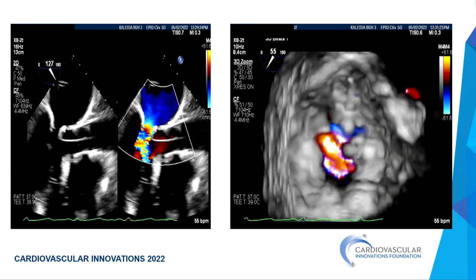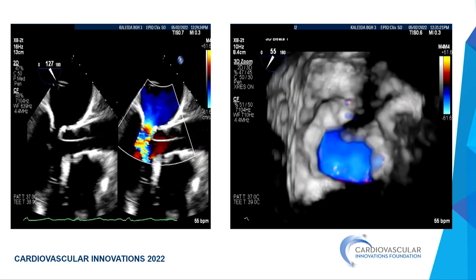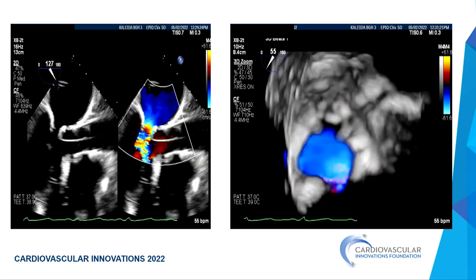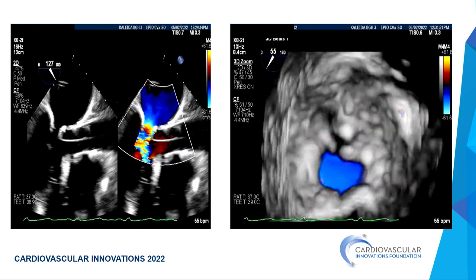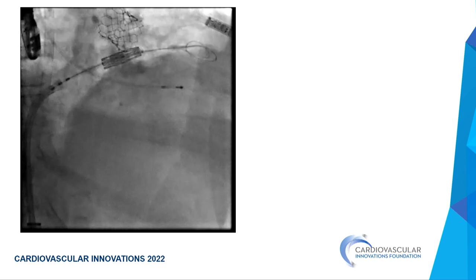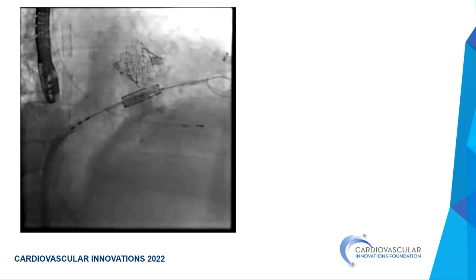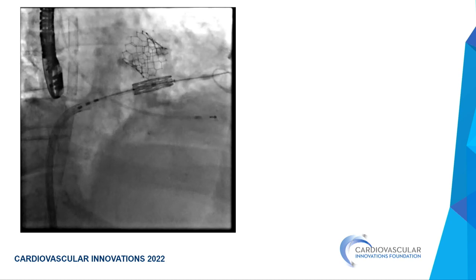I think fortunately what I have learned is that despite the laceration that has been shown, the MR never becomes an issue where you're running to stabilize these patients. They were just pretty stable through the whole thing. The rest of the TMVR is pretty standard. You can see the amount of calcium. And obviously, it doesn't matter how many times you've done this, to me, a valve in MAC is still kind of scary.